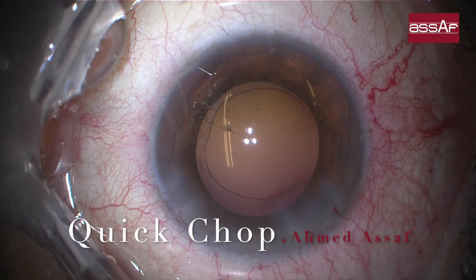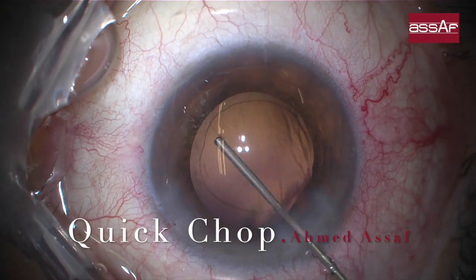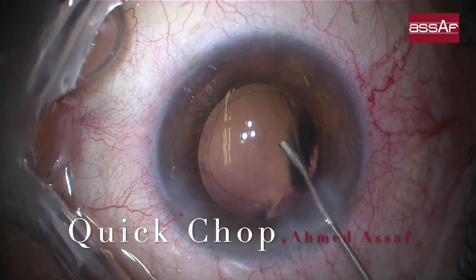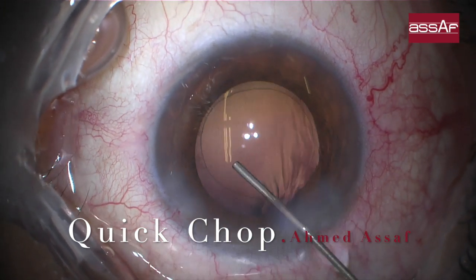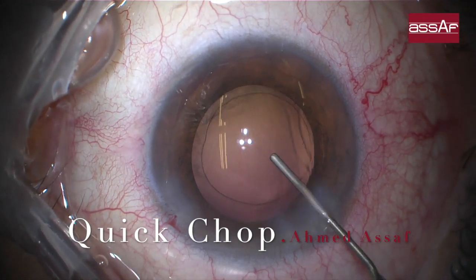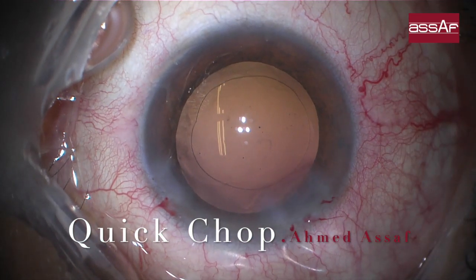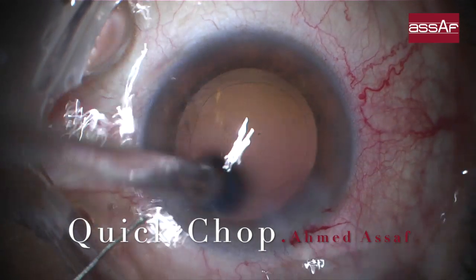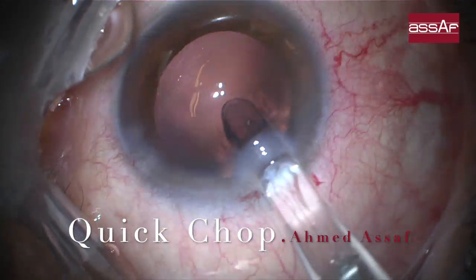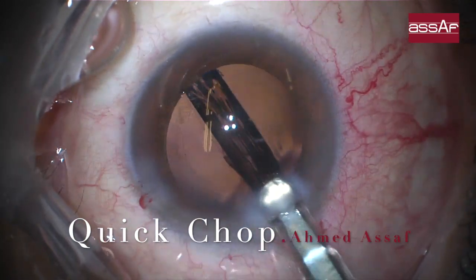Keep the irrigating bottle at the highest possible position to ensure sufficient irrigation to counteract the high aspiration and high fluidics during the quick chop technique. Quick chop is a vacuum-based technique that depends on high vacuum and high aspiration rate to ensure good followability and holdability during chopping. Now ready for IOL implantation — a single-piece IOL is implanted within a 2.2 mm incision inside the capsular bag, using cohesive OVD.